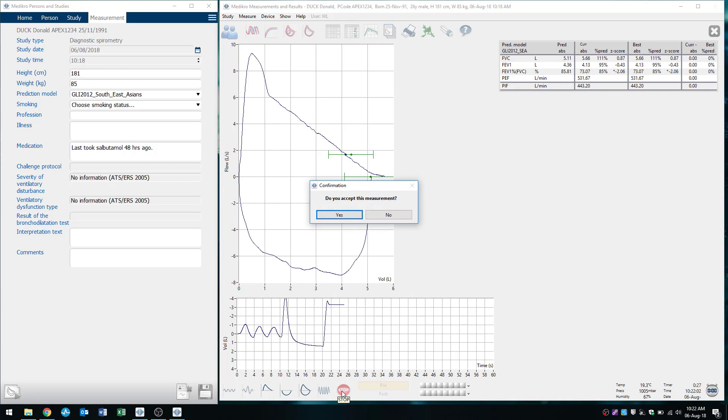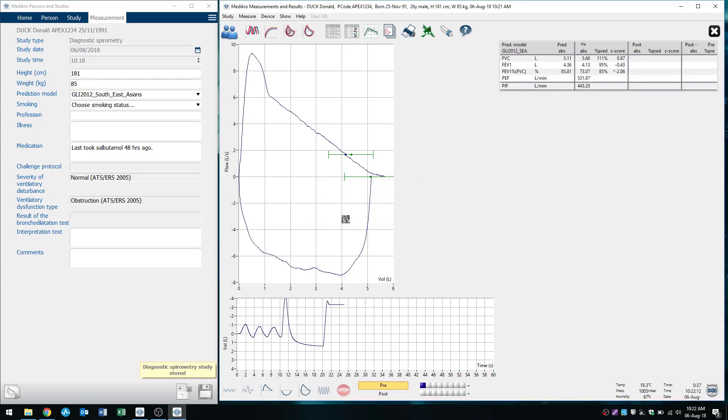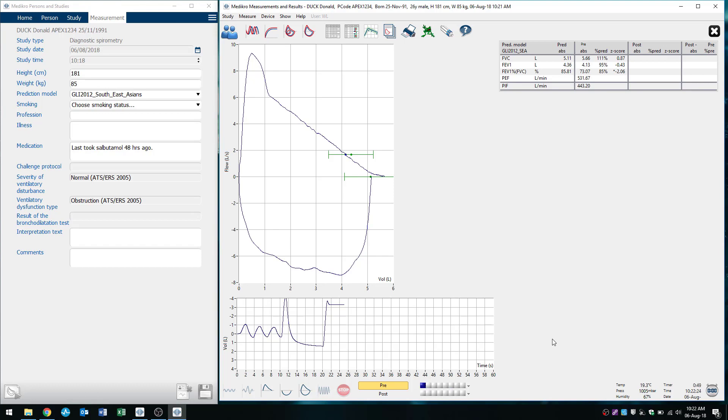All right, so after we've performed our blow, it will ask us if we want to accept our measurement. And in our case, yes, because that was a good blow. And that's one trial you can see at the bottom of the screen here next to pre, there's one blue square that's lit up. And as you do more trials, all of these squares will light up.